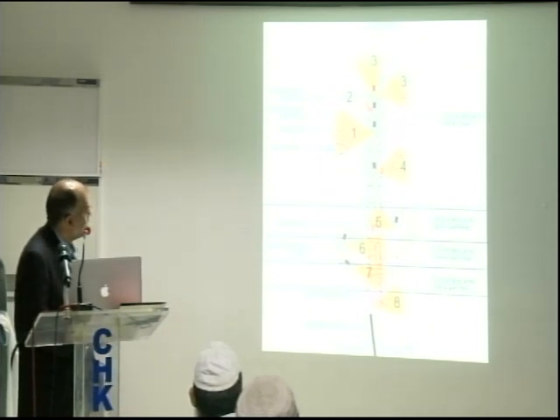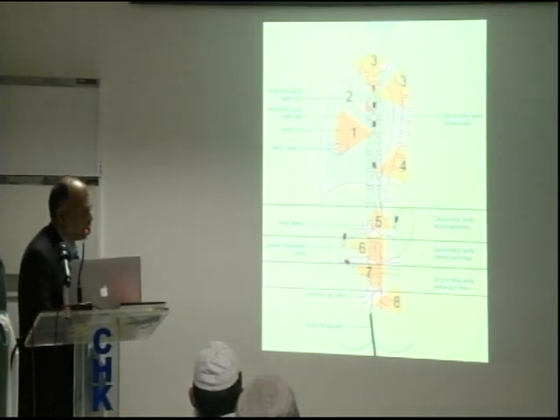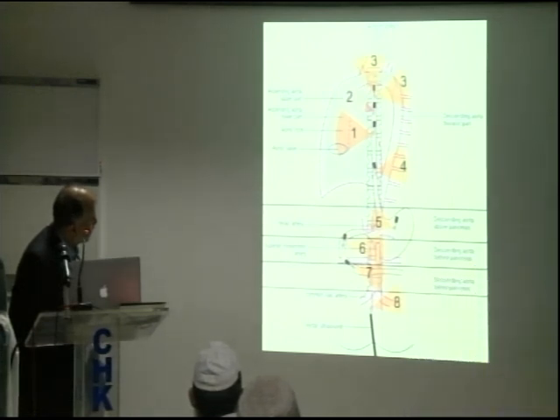Now I want you to flip this picture like this. Make it horizontal here. That's how the patient is lying. He's not lying like this, he's lying horizontally like this in the left lateral position. So if you flip that in your mind, this will come like this. You would have the carotid going up there, subclavian going up there, these vessels going up there, the aorta coming like this, the celiac, and they're coming like this.